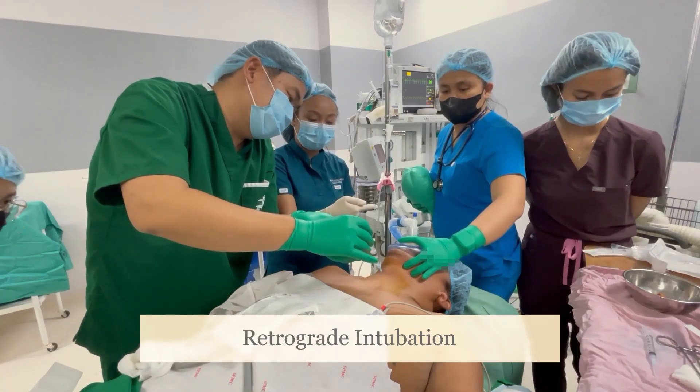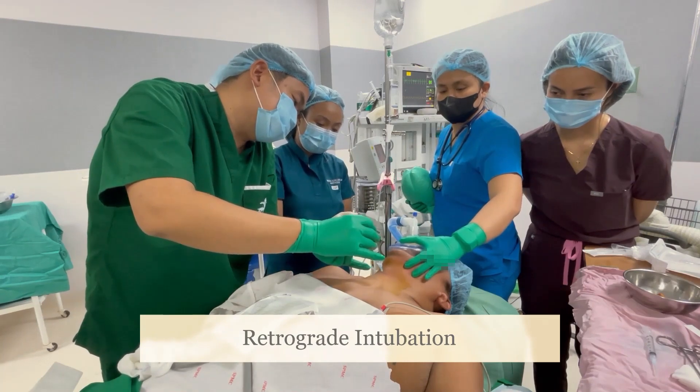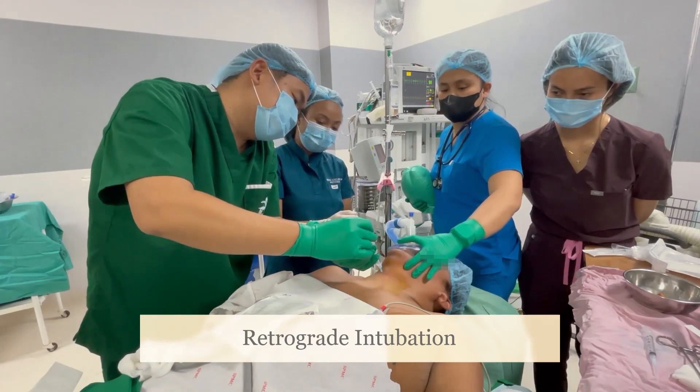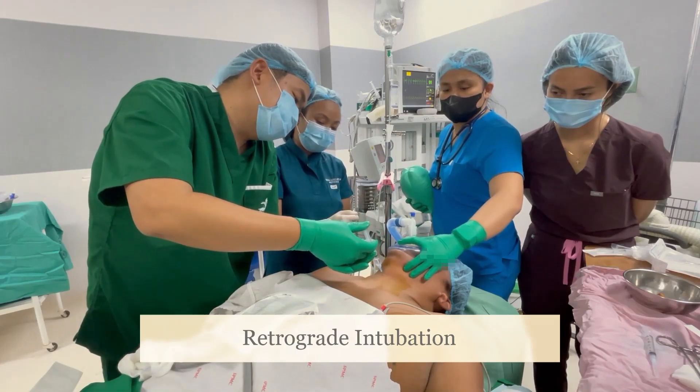Puncture the cricothyroid membrane with a 5cc syringe containing 2cc lidocaine. Aspirate to confirm placement. Gently deliver the lidocaine.